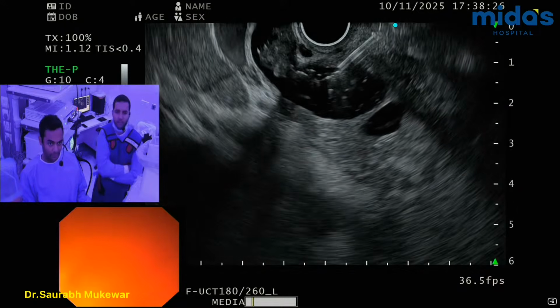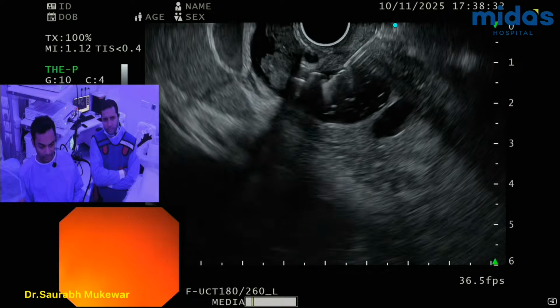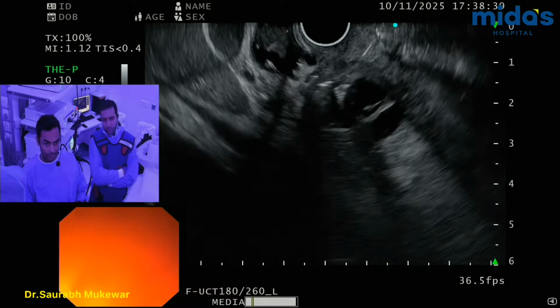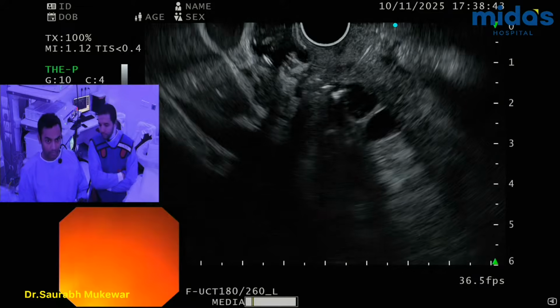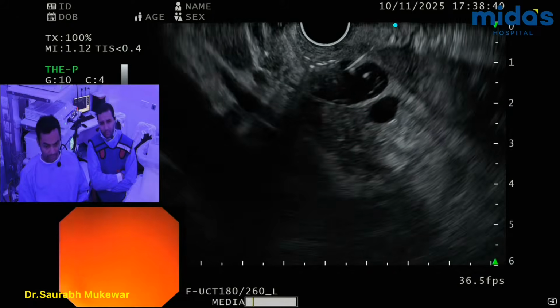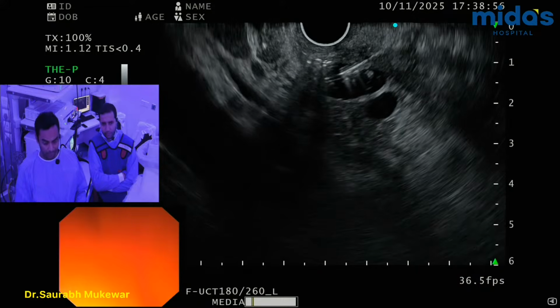Okay, now careful. Yeah. Lovely, going up. Fluoro? Yes, see, it's going where we need to be. Okay, perfect. Okay, good. Okay, exchange. Easy. All right. So obviously, different challenge here, the way the wire is going. No, 6 is okay.